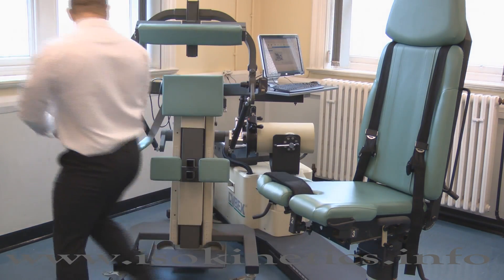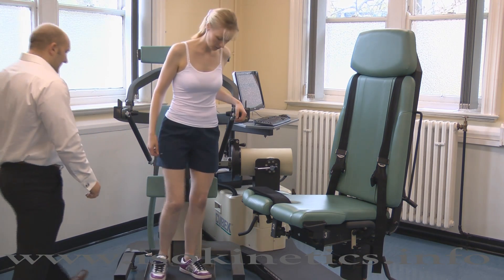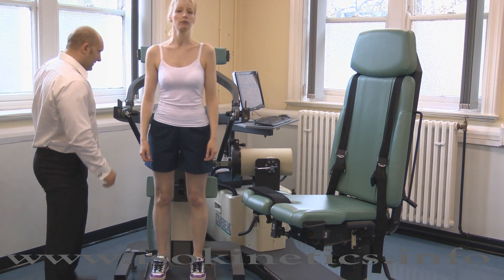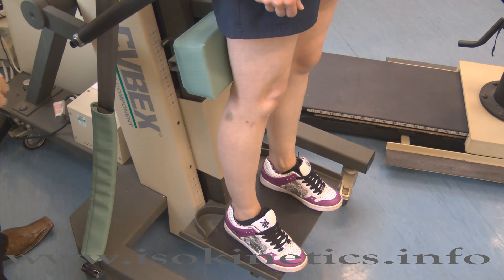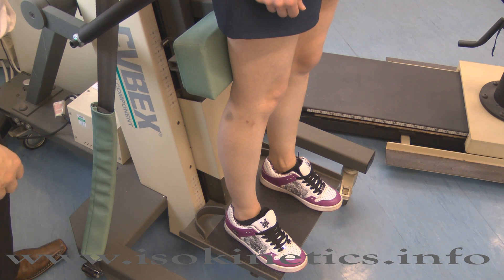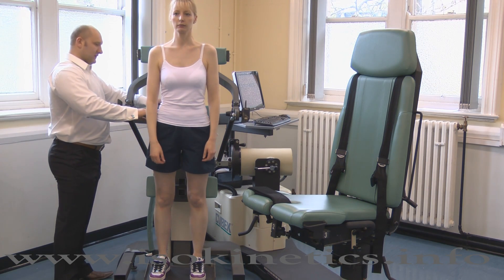Now position the subject onto the trunk module. Ask the subject to stand facing outwards. The foot position can be standardized by placing the heels into the heel cups on the plate. This is not compulsory — any foot position can be utilized.